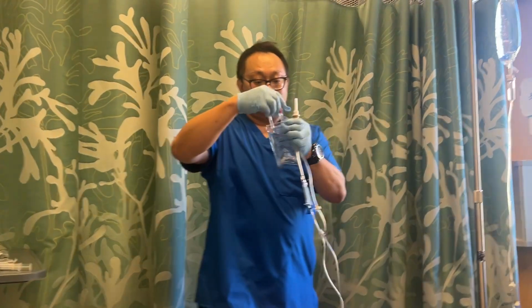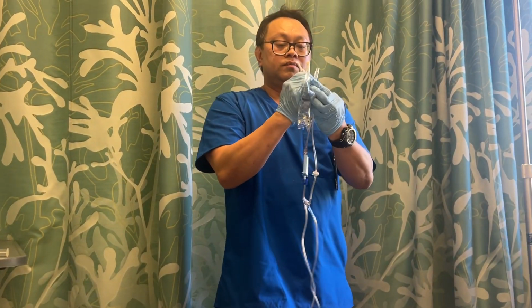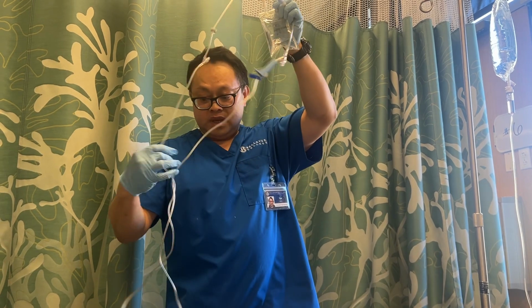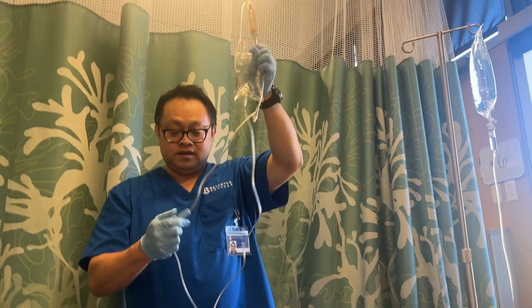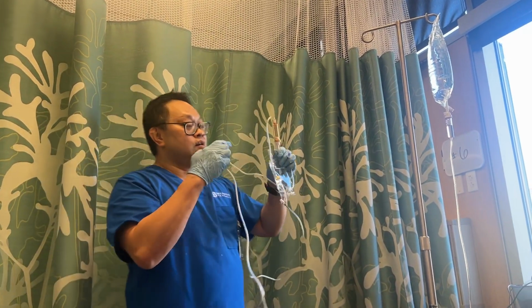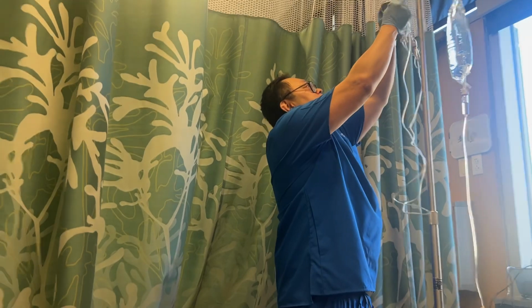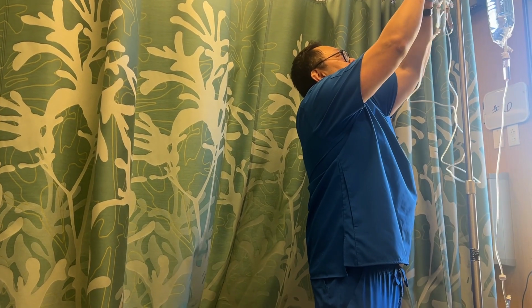I'm going to unplug this. All right, now I'm going to plug this in with this twisting motion, and it's in. And again, making sure that this is locked, okay? And a lot of these old tubing, they've been leaking.